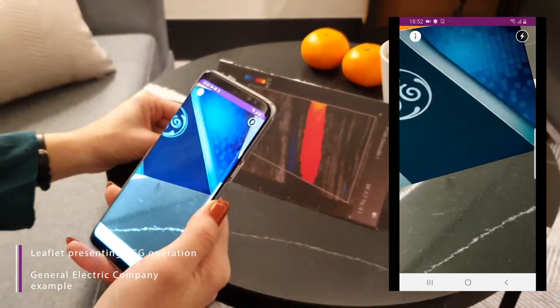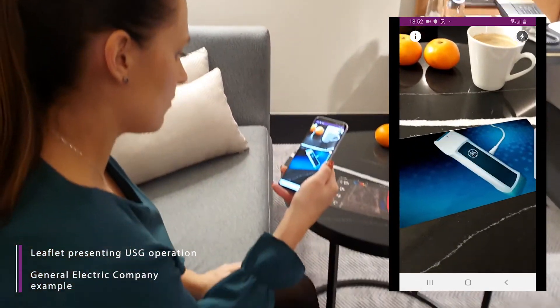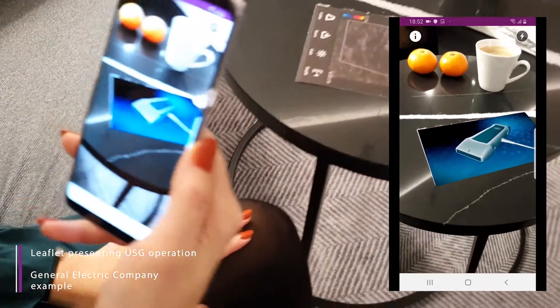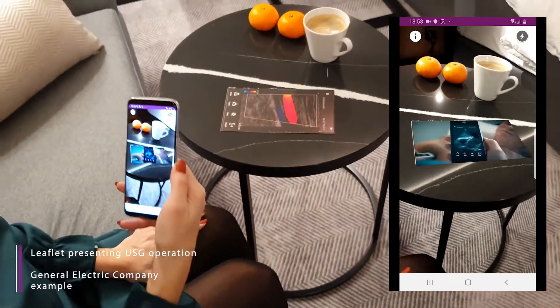The dual probe linear and sector transducers are always connected and always with you. There's no need to find the system and untangle the probes. V-Scan Xtend offers high-quality imaging out of your pocket.